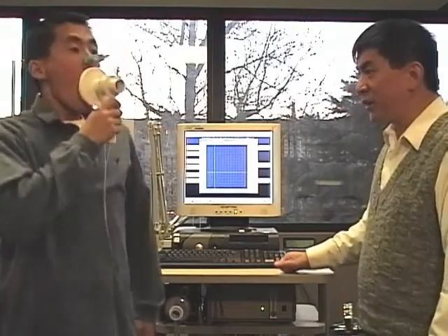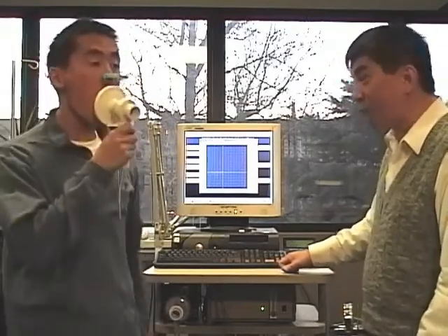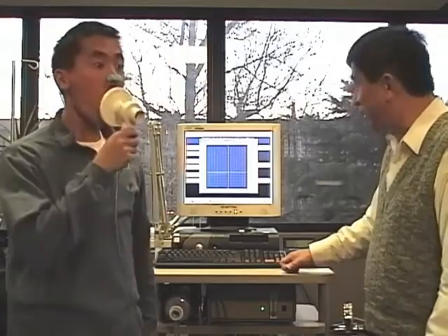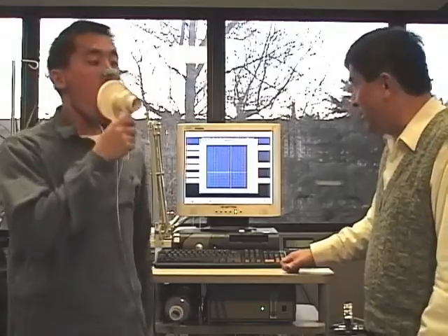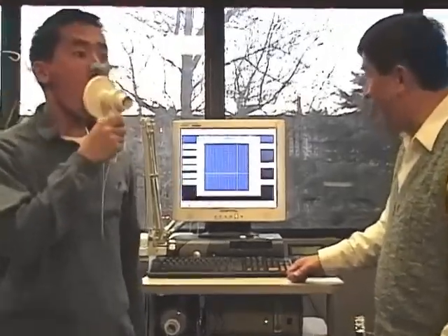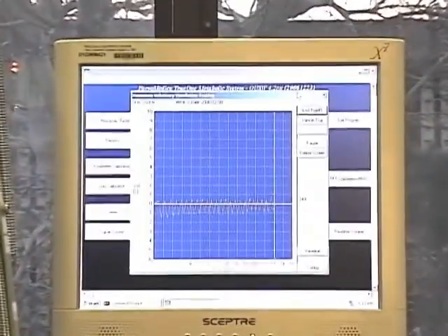Fast and deep, fast and deep — keep going, fast and deep.